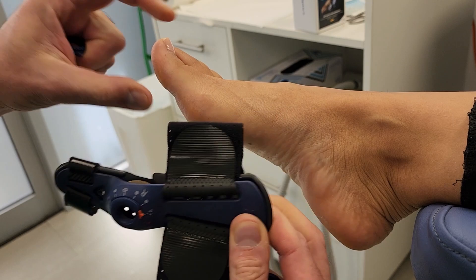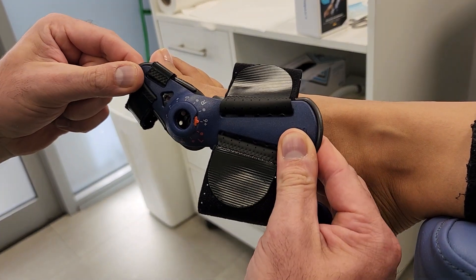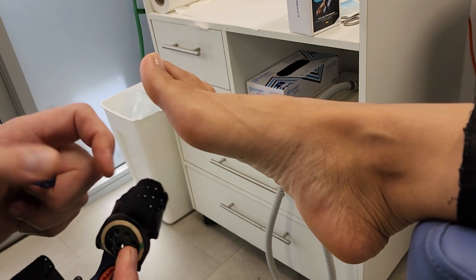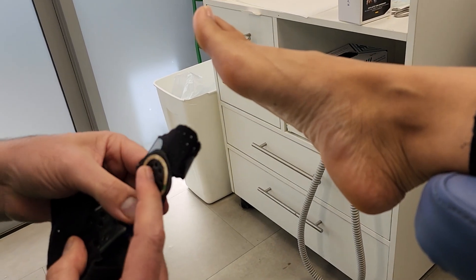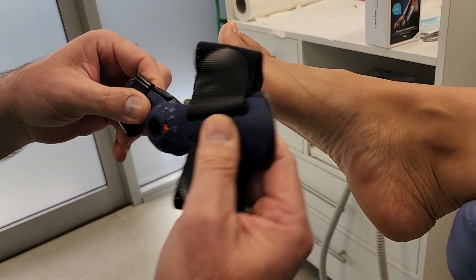So for someone who's had an injury, if this is zero degrees I usually keep them around the five to ten degree mark — so about there. Once you've got the angle set, you can pop this back inside and it's set.